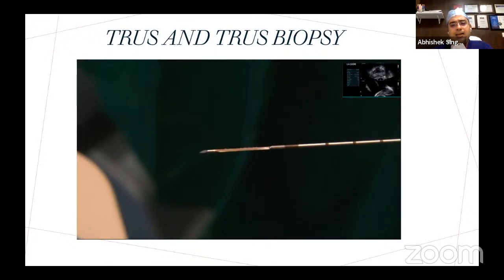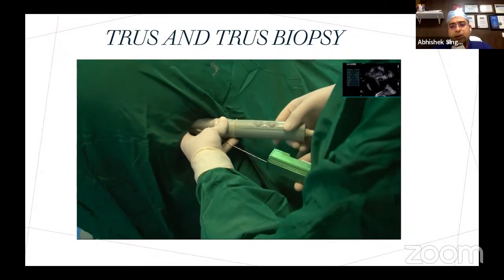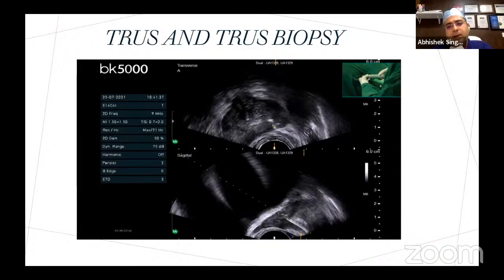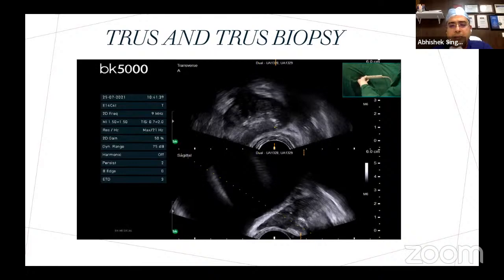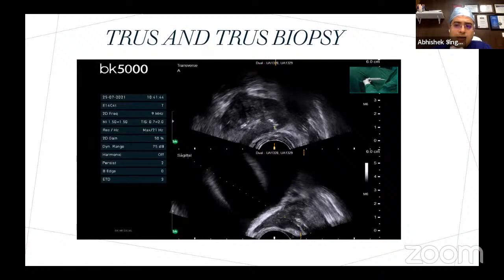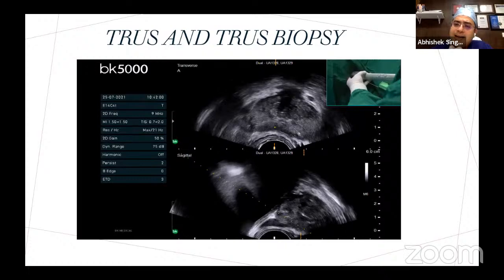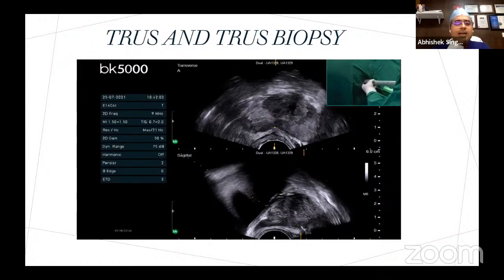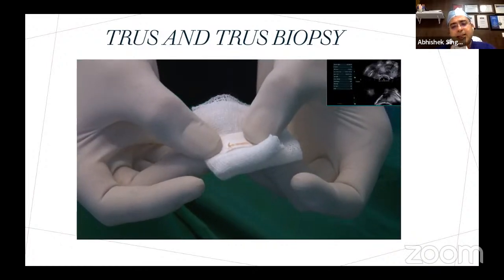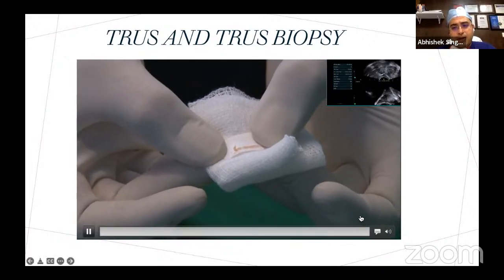The biopsy will be done sequentially as is being taught to us. So this is not a forum to discuss how you would do biopsy. We'll do a double sextant, of course, and they'll be laterally directed. But what we want to discuss is the importance of ultrasound in achieving the biopsy. So you decide the trajectory after local anesthesia, which is infiltrated, and take the laterally directed biopsy. Again, the core length should be 22 mm, which is very, very important.